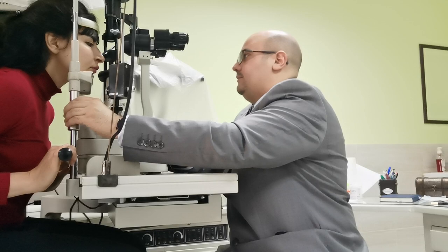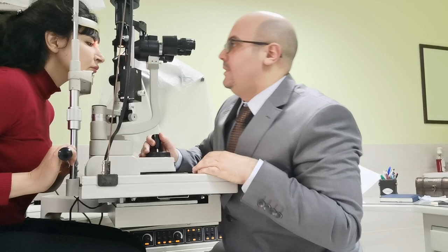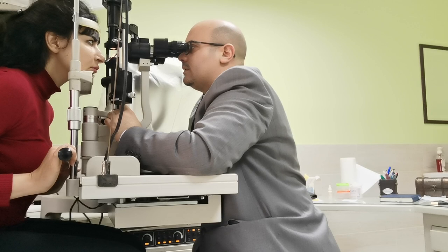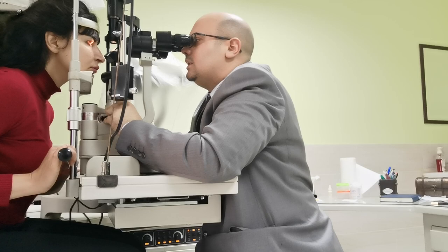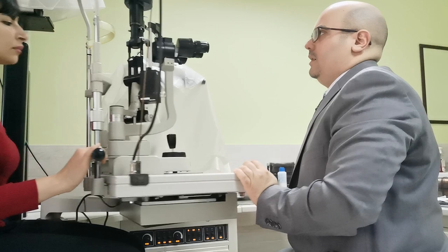This is where you put the eye. Then you open the slit lamp and try to check the entire segment — please look in front. So you go and check the right and the left eye.